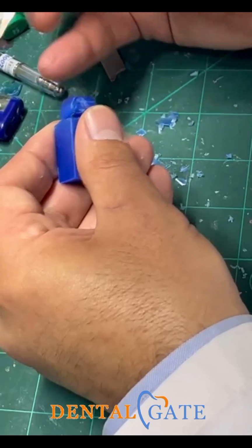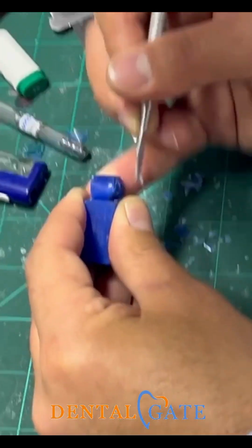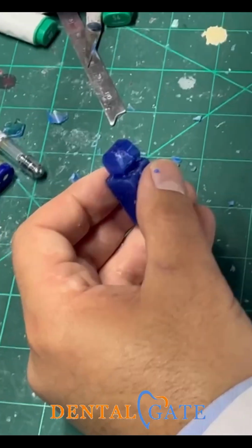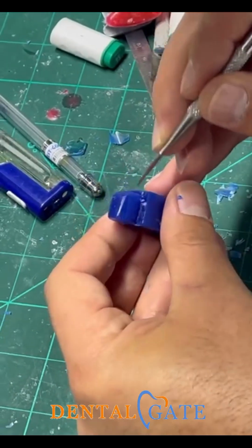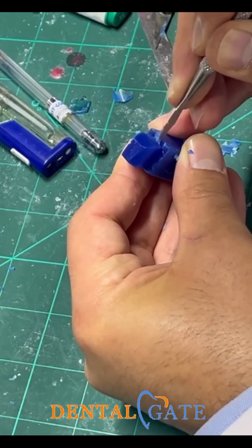So don't make it severe, just make a roundation here. Reshape this outline, and make the surface according to the outline here. Now, don't make the lingual now, just double check the curve and all features of the outline.